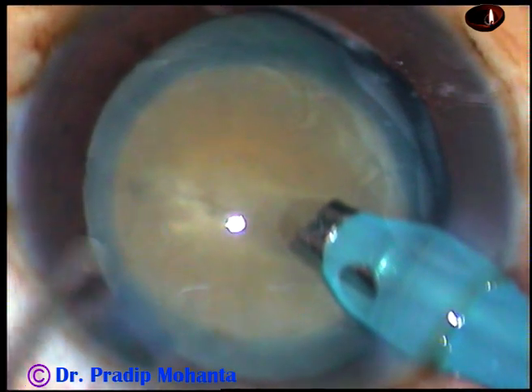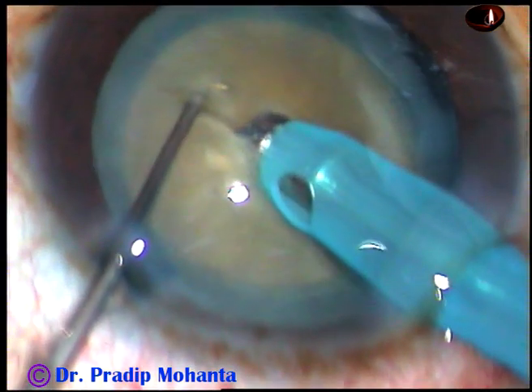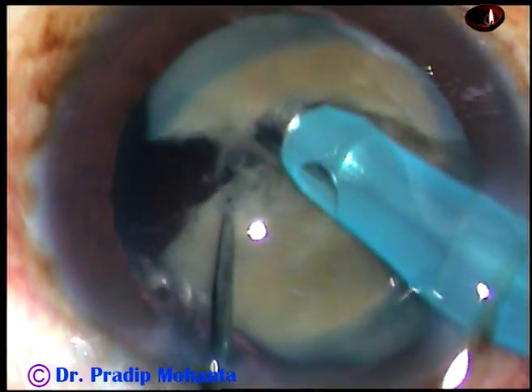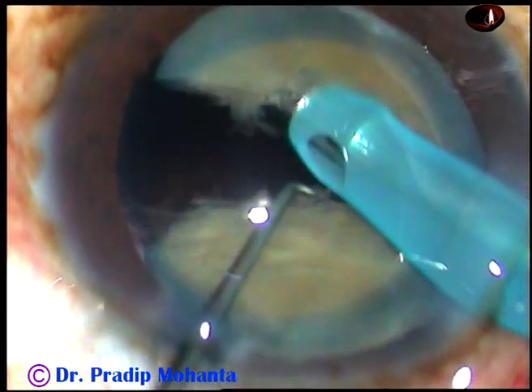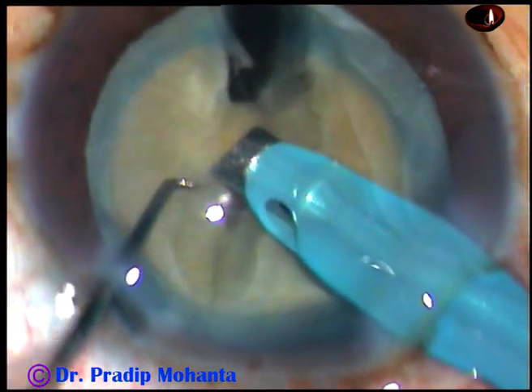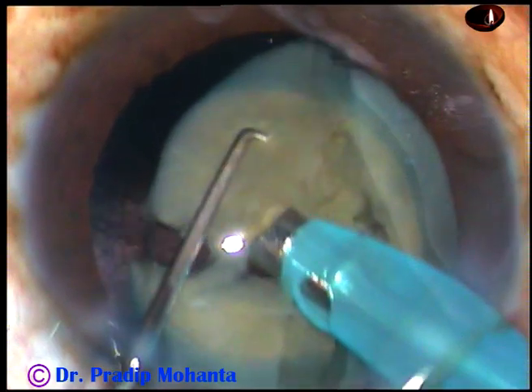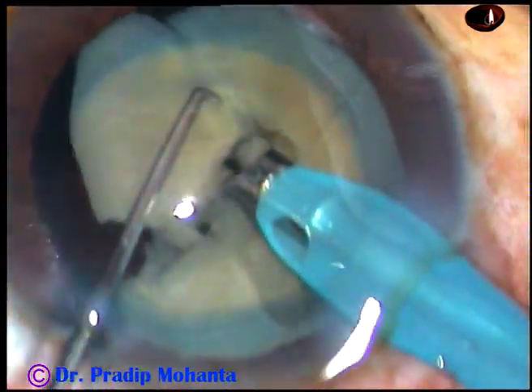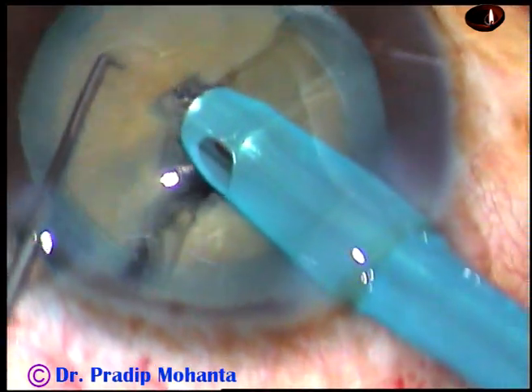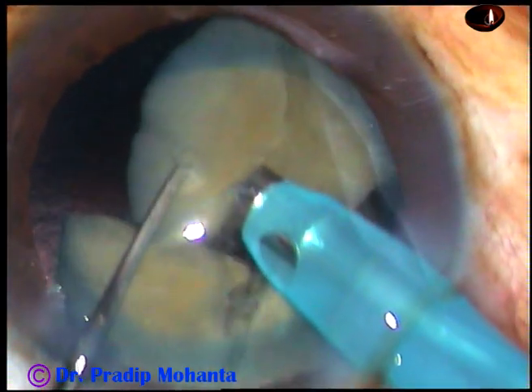And now I am going to engage the tip of the phaco needle in the tunnel that is already prepared. As I go through the tunnel, the nucleus is very stable and I can make a nice crack. And now I rotate, hold this hemi-nucleus and make another crack. Then I come to the other hemi-nucleus and engage the tip into the substance of the nucleus and make another crack.